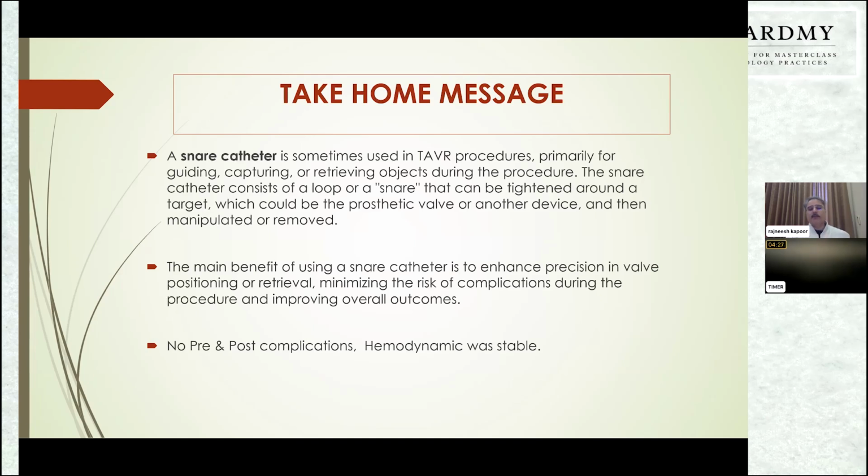So then it settles. Preempting, planning, and just discussing prior to the case is much better rather than confronting the complications later on.